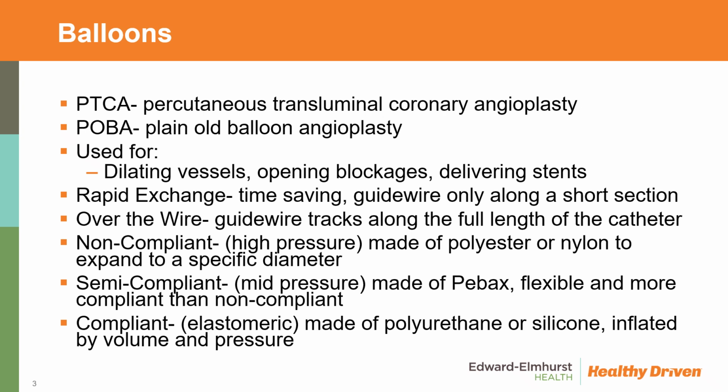There's rapid exchange, which is time-saving, and there's only a guide wire that goes through a short section, compared to the over-the-wire balloons where the guide wire will actually track along the full length of the catheter. It's easier to see those kind of hands-on, and we've got some practice equipment that we can use that's above the cabinets in Lab 3.